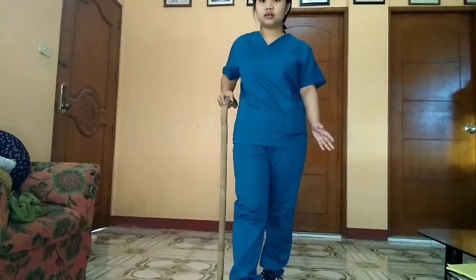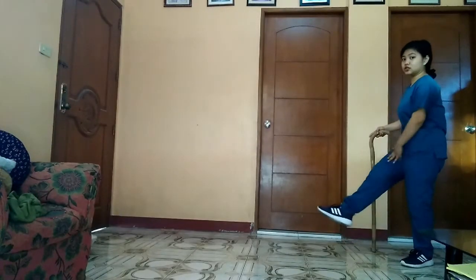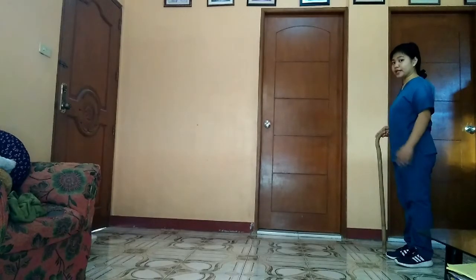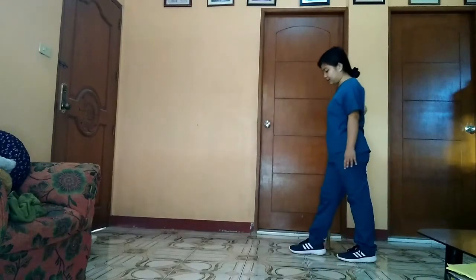Let's try to walk. Assume that this is the weak side of my leg and then this is the strong side. Okay? Move your cane and the weak side of your leg forward, followed by the strong side.